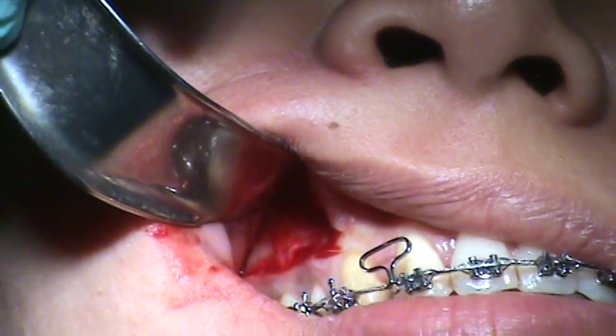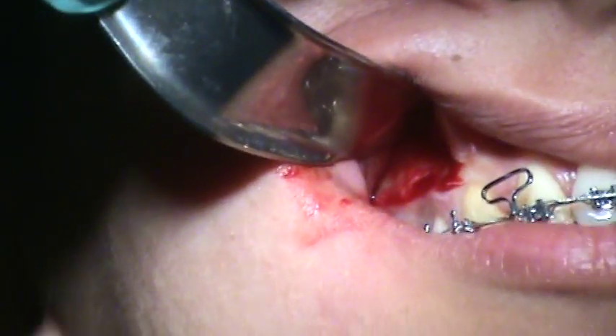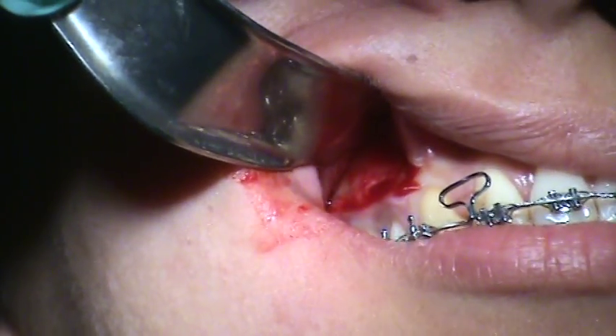Is this a placement that you... I think we had a slightly smaller one. No.